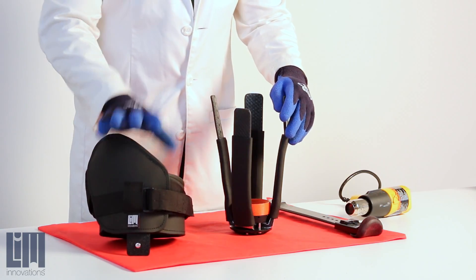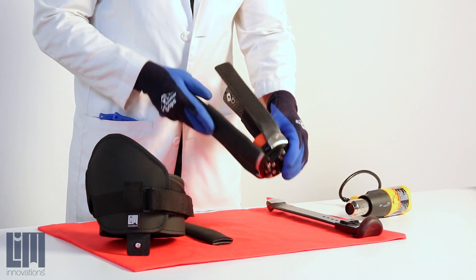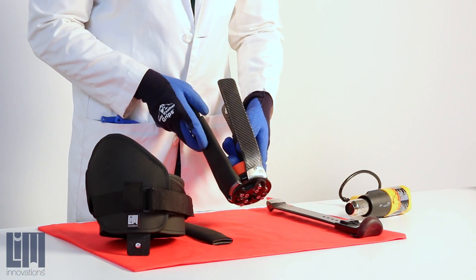What we need to do is remove the brim, and you'll need to remove your strut cover or your strut sleeve, move it out of the way, and expose your carbon fiber.